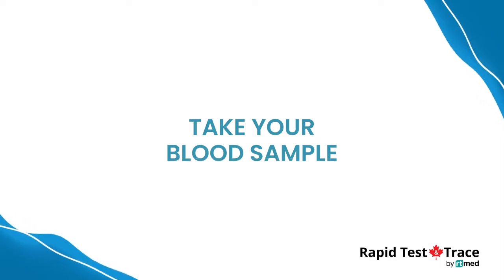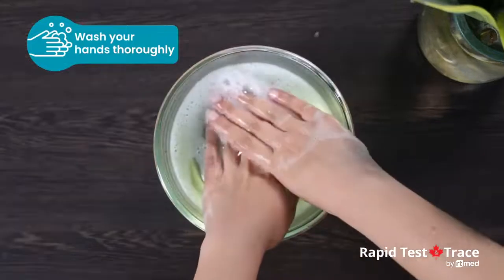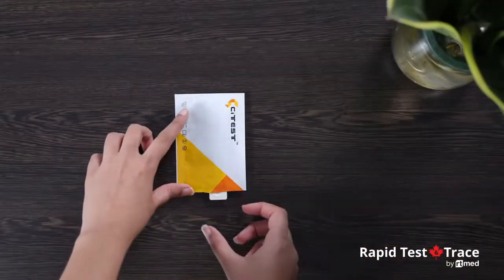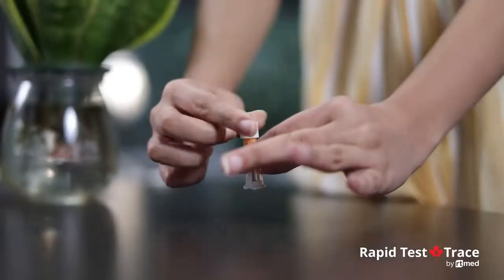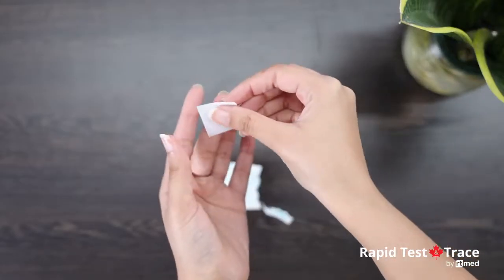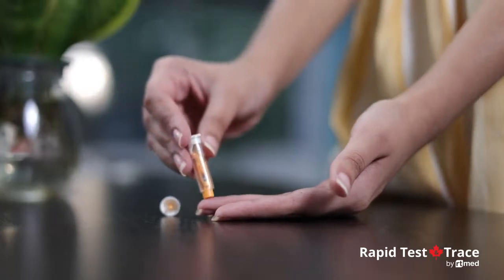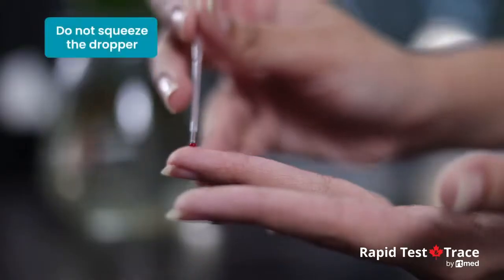To take your blood sample, open the pouch, remove the test cassette, and place it on a clean level surface. Use the provided alcohol pad to clean the fingertip of your middle or ring finger as the puncture site. Press the lancet on the side from where the cap was extracted — the tip retracts automatically and safely after use.